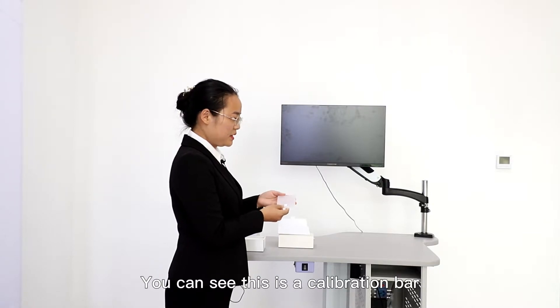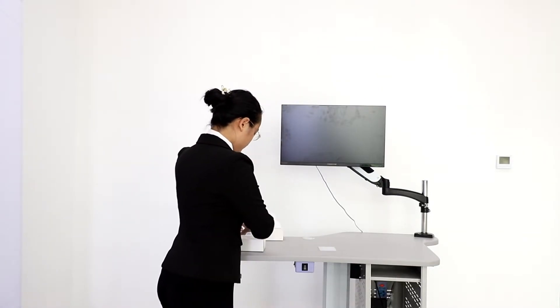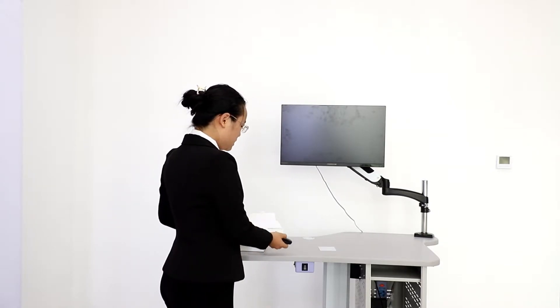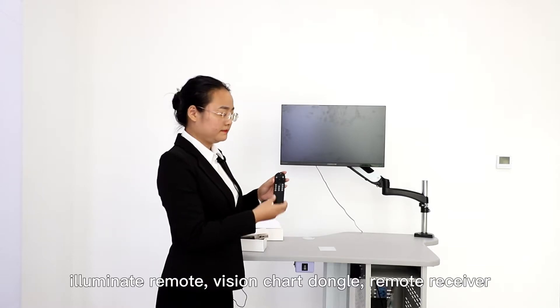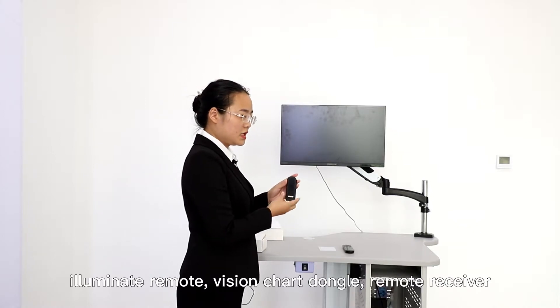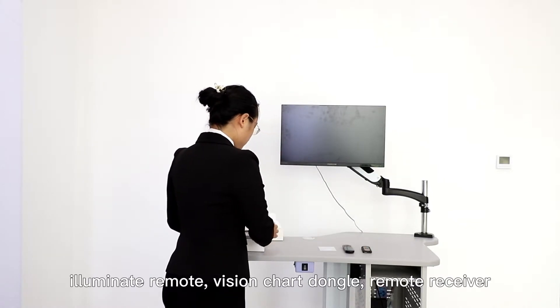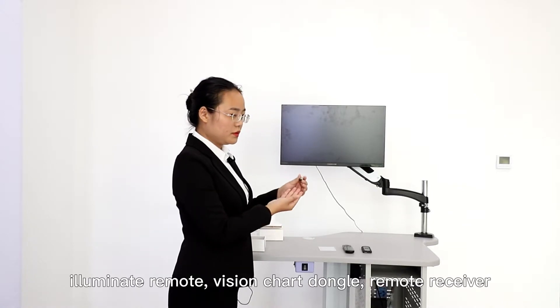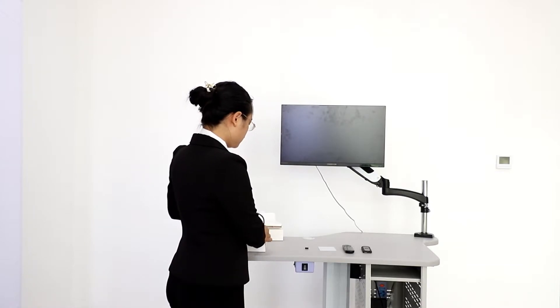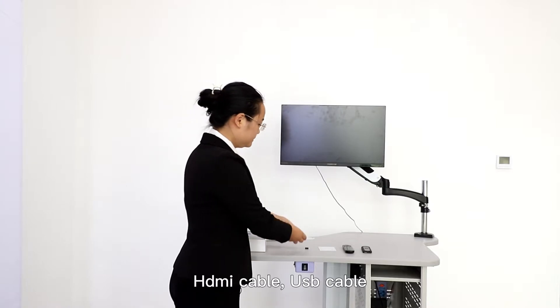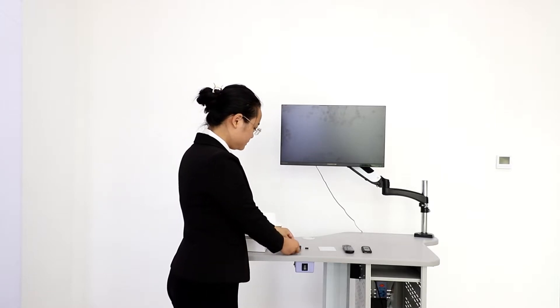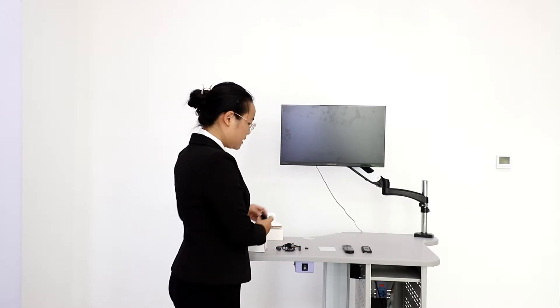You can see this is a calibration bar, illuminate remote, vision chart dongle, remote receiver, HDMI cable, USB cable, and power adapter.